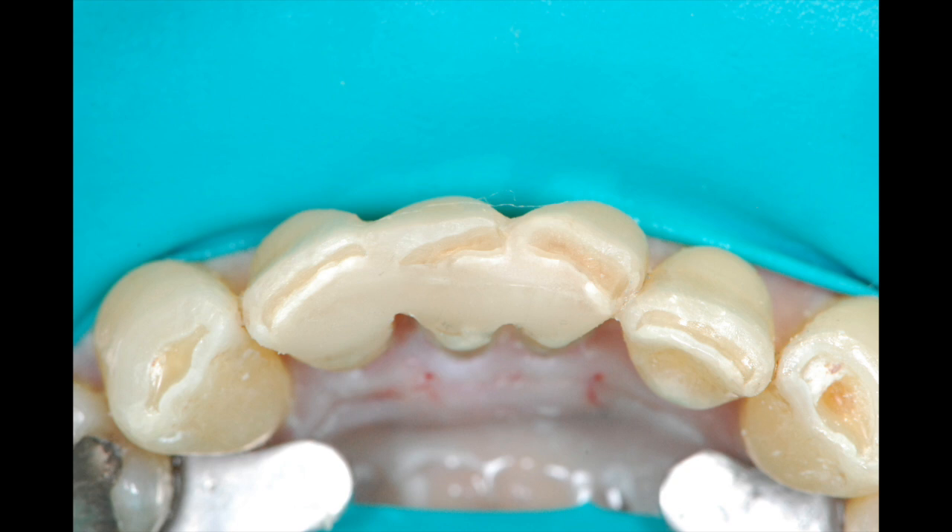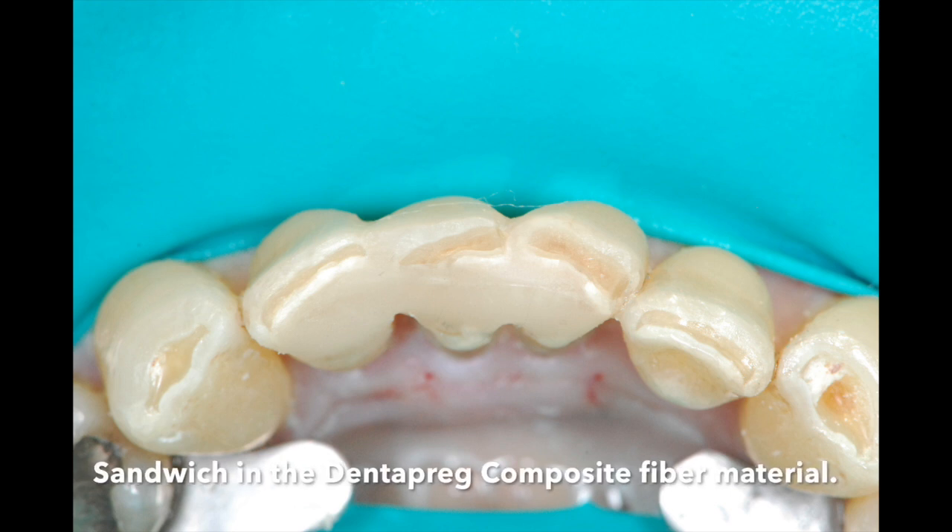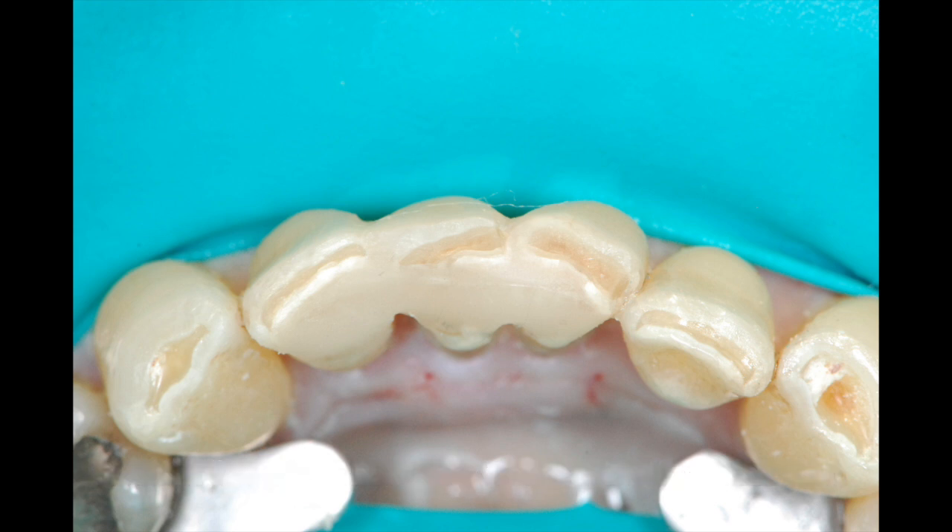A small amount of composite will be laid on the lingual. Then a piece of 2mm Dentapreg composite-reinforced fiber will be embedded into this material, and then a thin layer of composite on top in a sandwich technique.